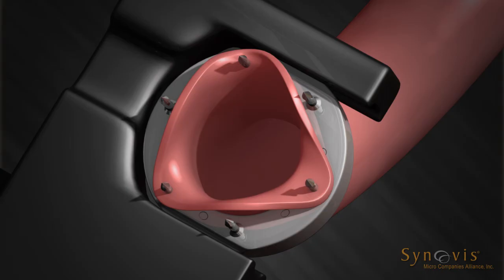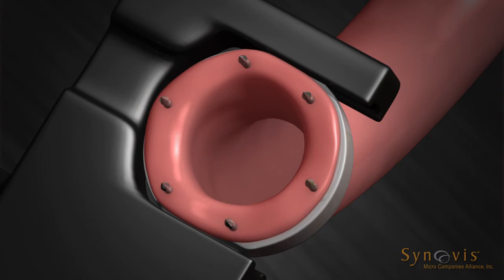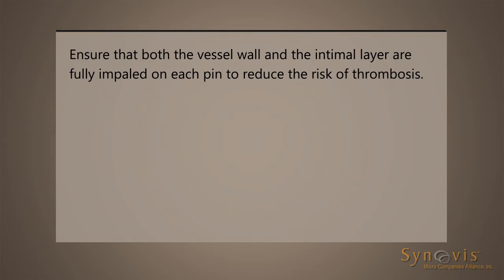Complete vessel placement on the ring by impaling the vessel onto the remaining three intermediate pins. Ensure that both the vessel wall and the intimal layer are fully impaled on each pin to reduce the risk of thrombosis.